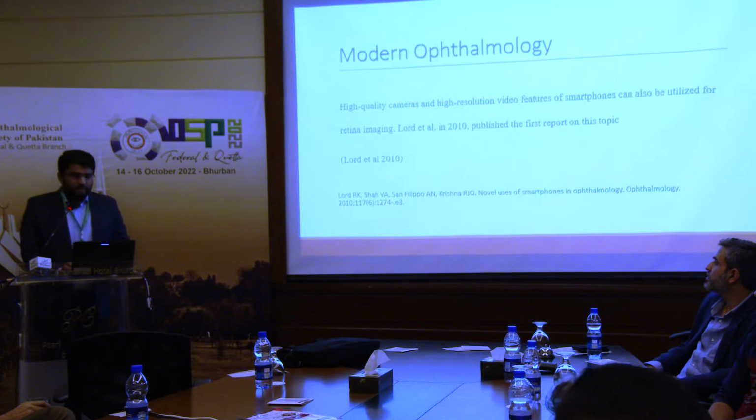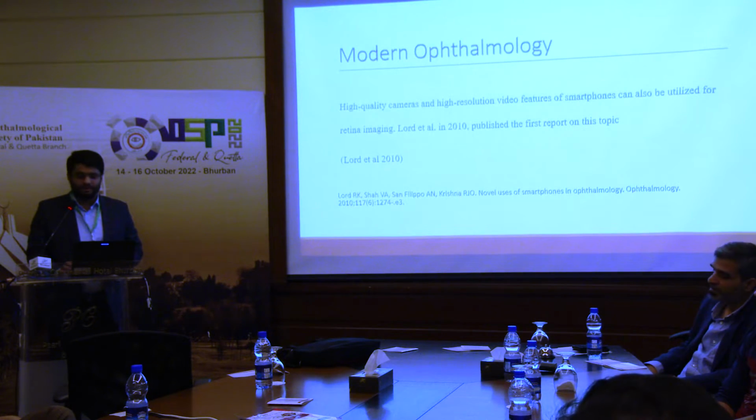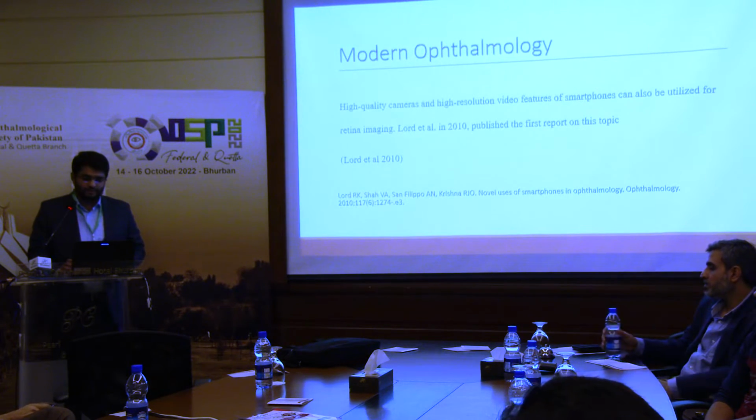Now with the advent of high quality, high resolution cameras in smartphones, this feature can also be used to take pictures of the fundus, on which the first report was published in 2010.